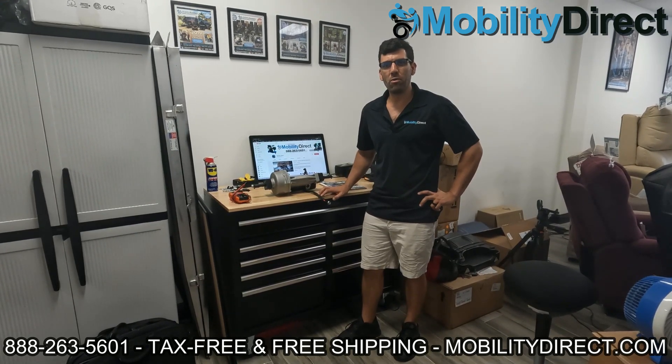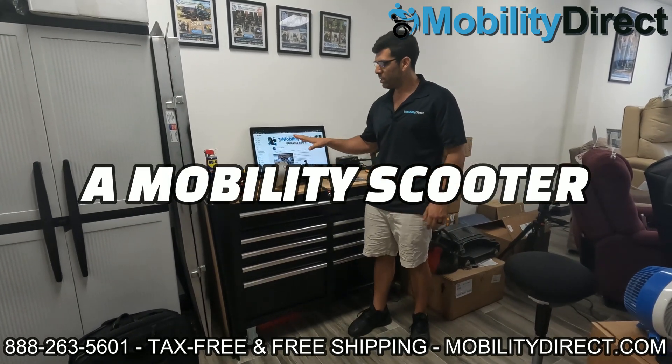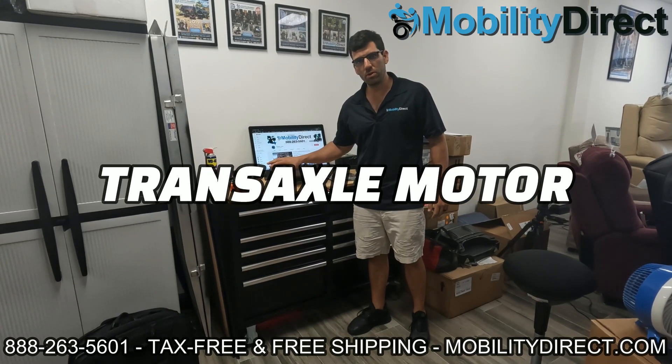Hi everybody, I'm Sergio with Mobility Direct and welcome to our YouTube channel. In today's video, we're going to show you how to troubleshoot a mobility scooter transaxle motor assembly.